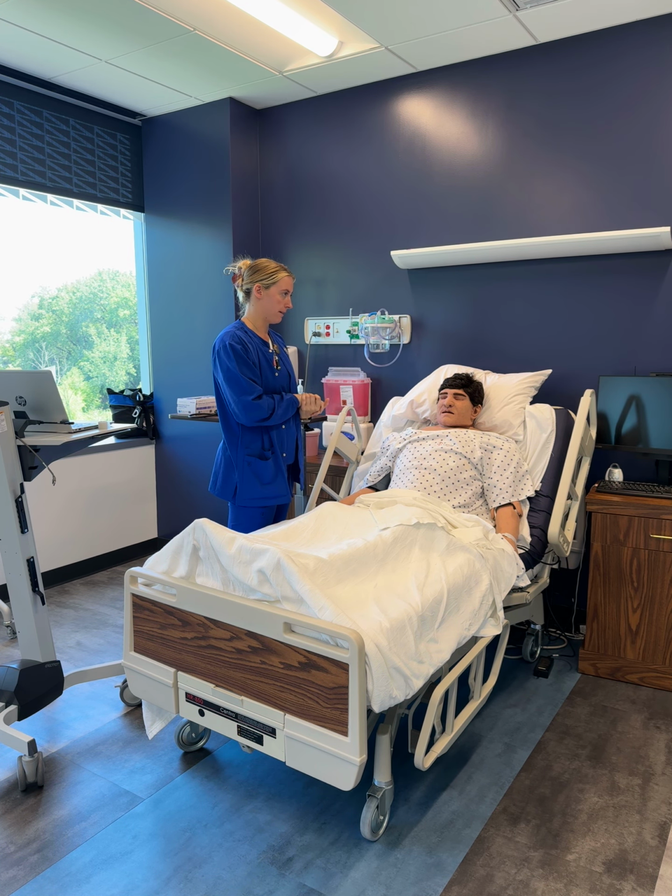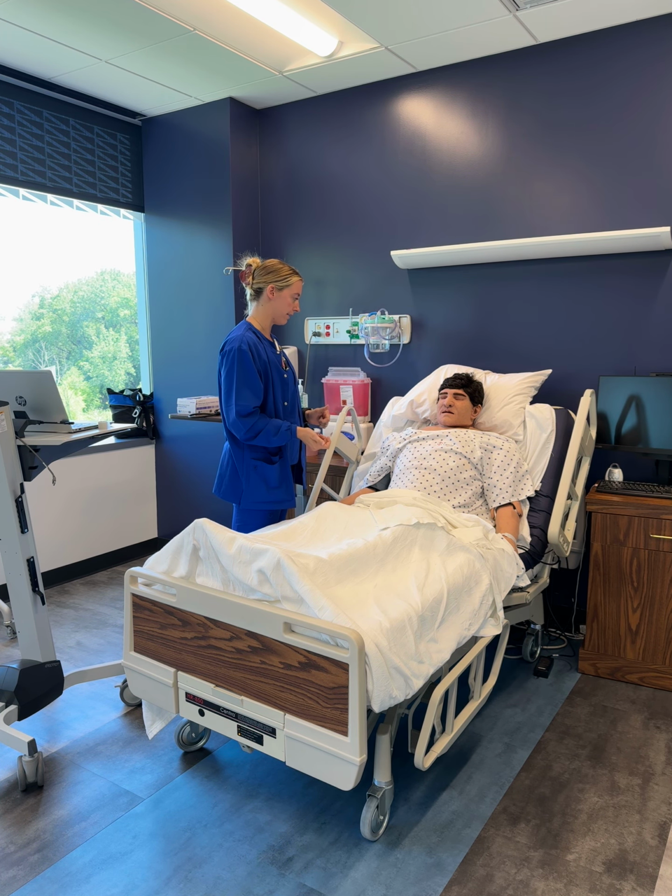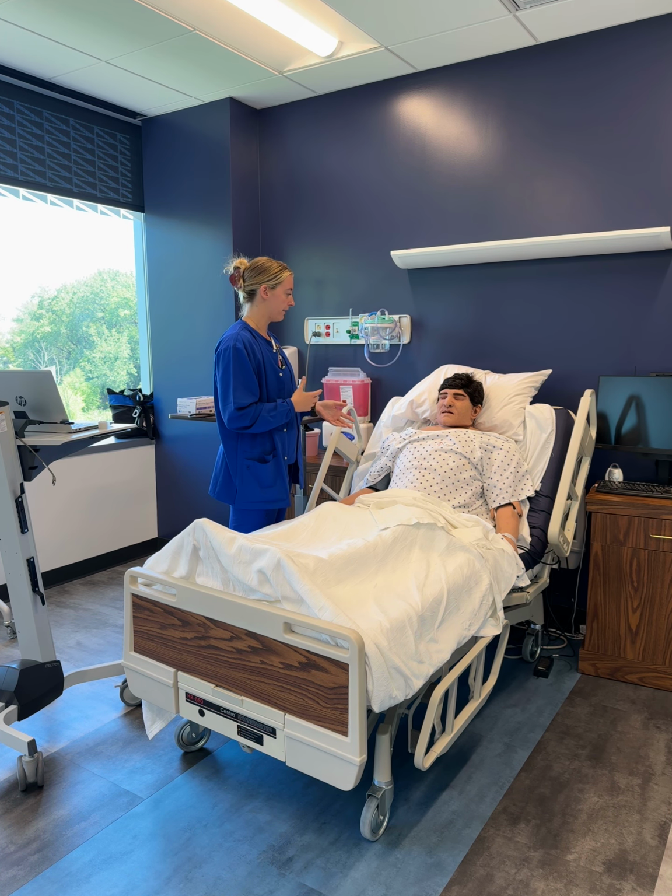We're going to tell the patient about communication methods during the process because we're not supposed to talk. So we're going to tell the patient, you can just tap me or do a thumbs up or a thumbs down. If you want me to stop, you can tap me or do the thumbs down. You may experience some gagging or discomfort during this process. Do I have your consent?